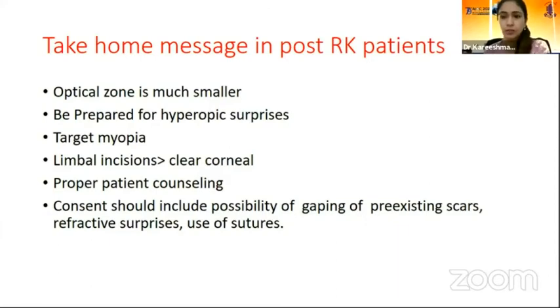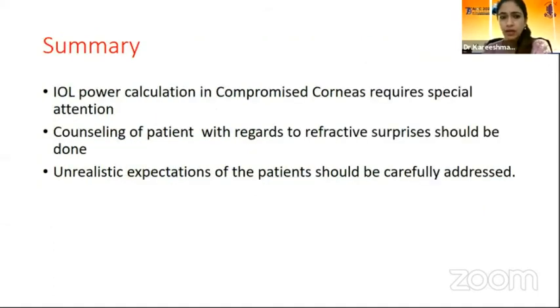So explain that to the patient and always have a suture ready on standby, because the gape of the pre-existing wound may happen at any point during your phaco. Also try to keep your parameters as low as possible.